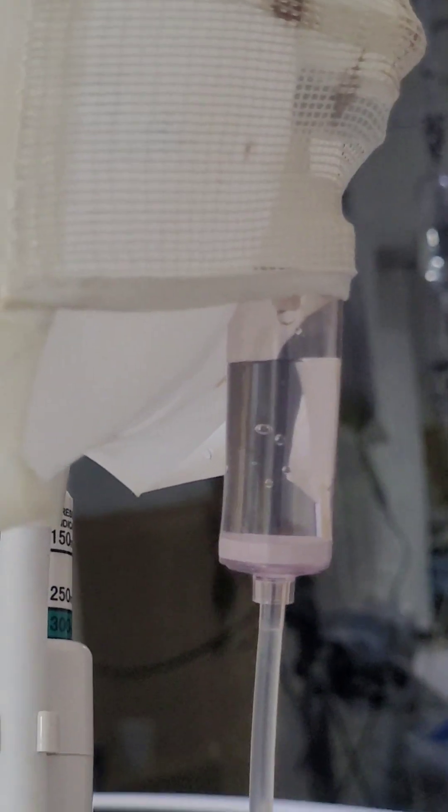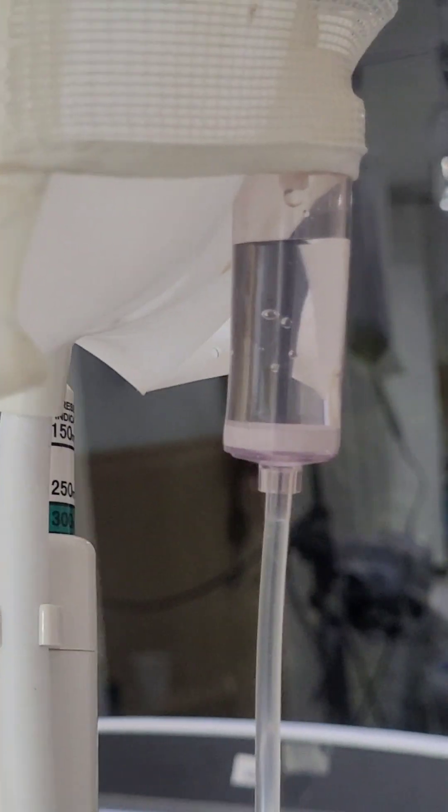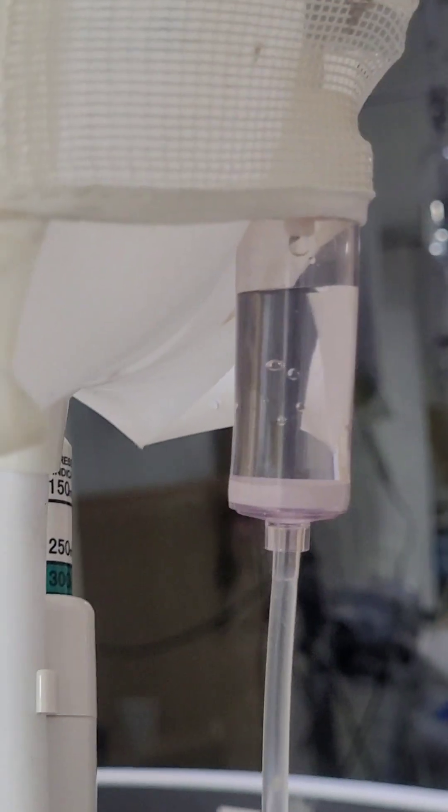This is for the fast flush. Right now you can see NS is going drop by drop. But if I do the fast flush — just see — this is called fast flush.